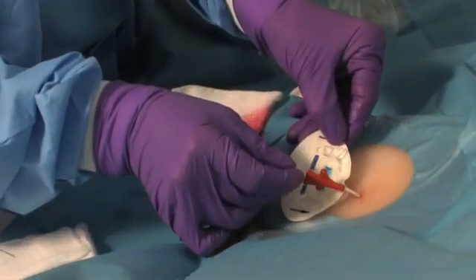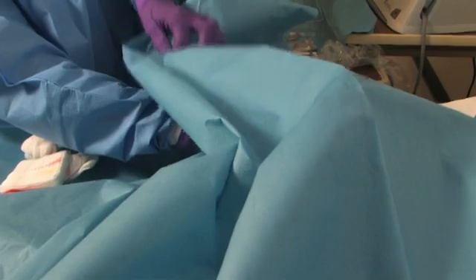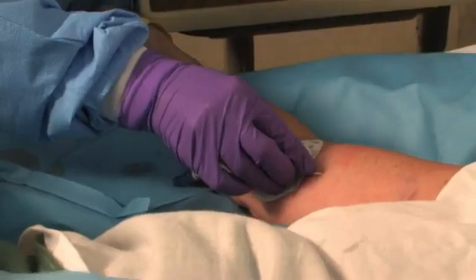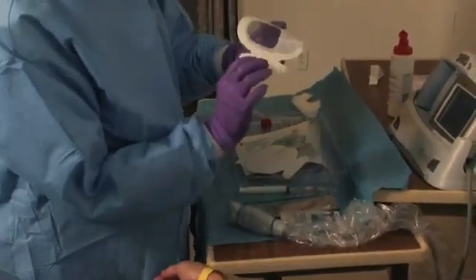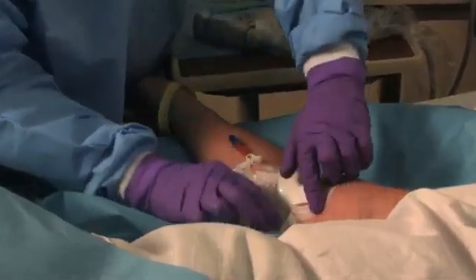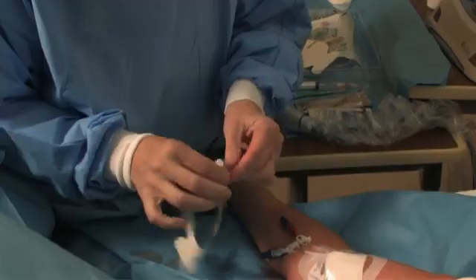The clinician secures the PICC line to the patient's arm with an adhesive securement device to ensure the catheter does not migrate out of position. She removes the sterile drapes and discards them, then covers the insertion site with a transparent film dressing. A chest x-ray must be taken to verify that the PICC tip has been properly placed in the superior vena cava. The clinician then documents confirmation of the tip location in the patient's medical record, including the date, time, person reading the x-ray, and confirmation that the PICC is ready for use.